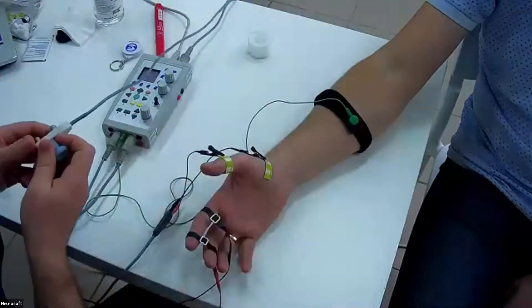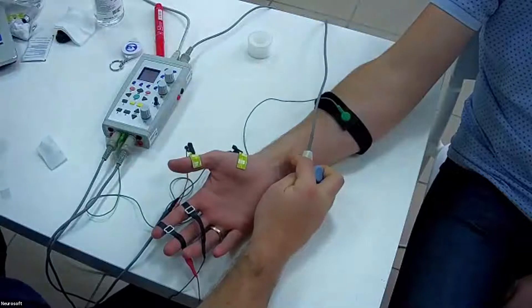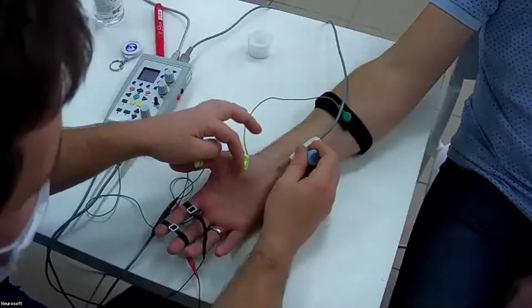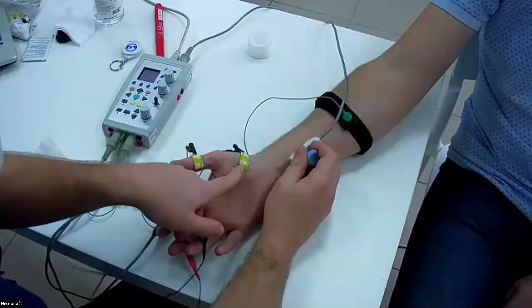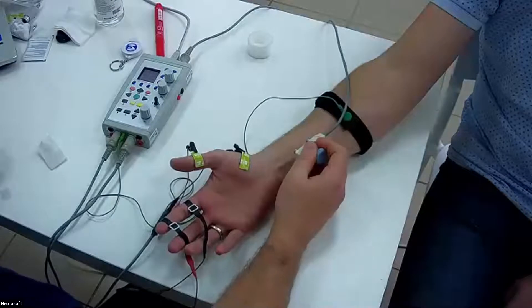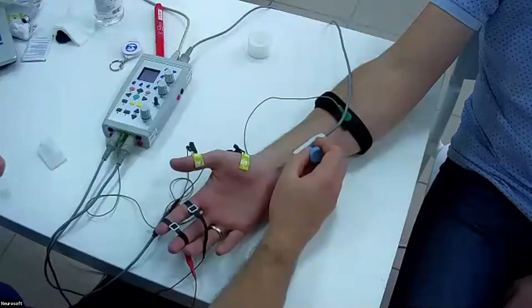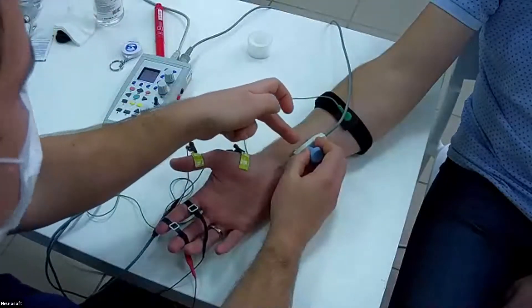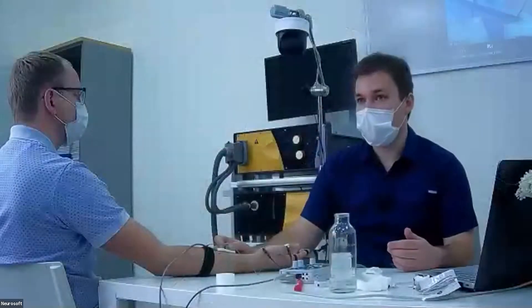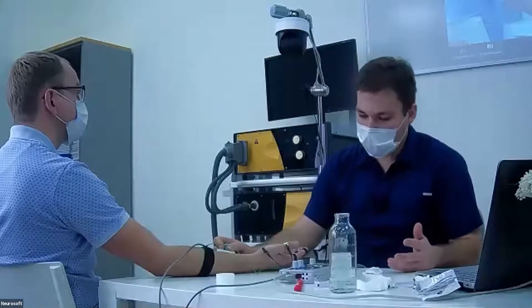We wet the stimulation electrodes. We find the tendon of the palmaris muscle, and near that landmark we stimulate — the distance from the recording electrode should be about 8 centimeters. The cathode is the more distal electrode, so the active minus electrode must be positioned distally, with a distance of about 7 to 8 centimeters from the recording site.